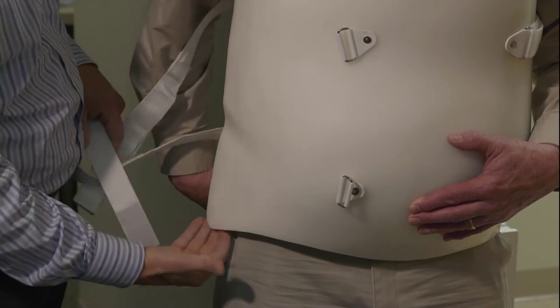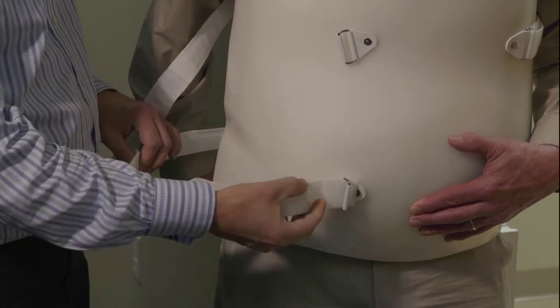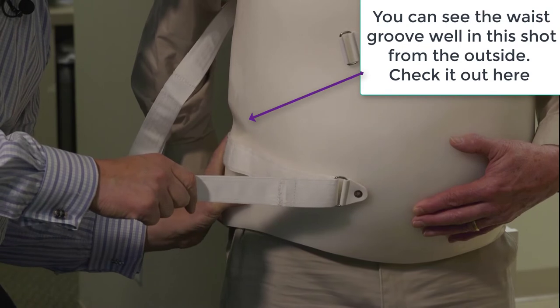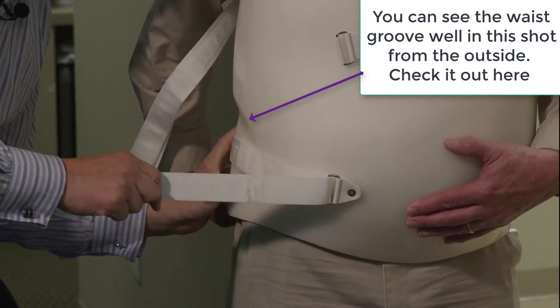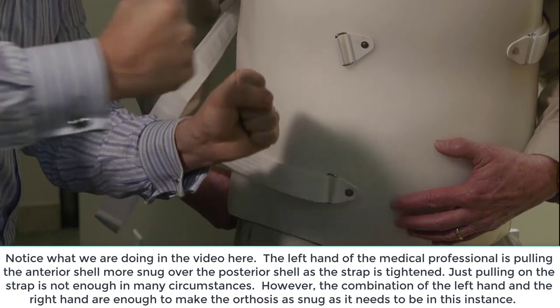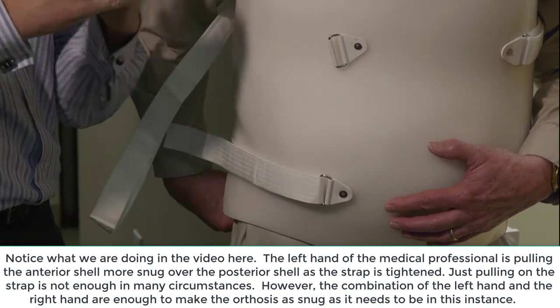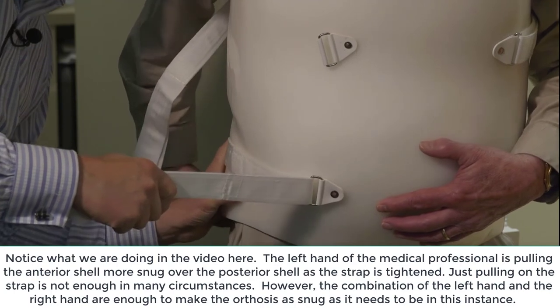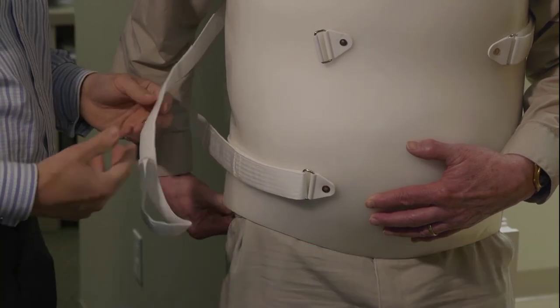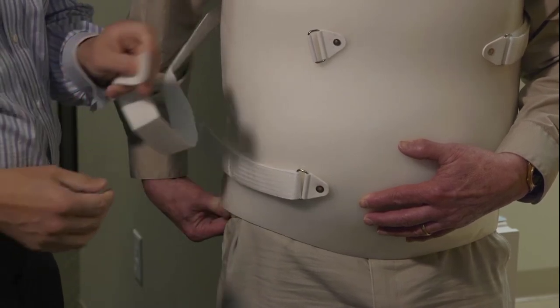The brace isn't on 100% yet — you can see there's space involved. We're going to do the distal strap on the patient's right-hand side. What I tell patients to do is pull the two pieces of plastic together if they can, and then pull the strap at the same time — it helps to cinch it down. It's not like a shoe where you can just yank on the strap. You pull back and really tighten down, because these braces are all meant for motion control. A loose brace does not reach that end.